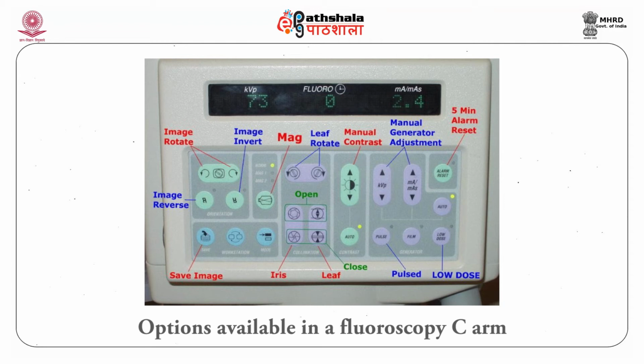If we collimate the image tightly, the images have better contrast, as well as the scatter to the operators is reduced. We see here the iris of that collimator, as well as some wedge filters are available to have uniform intensity in the X-rays, so that our image has uniform intensity.